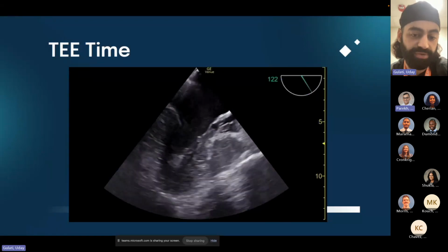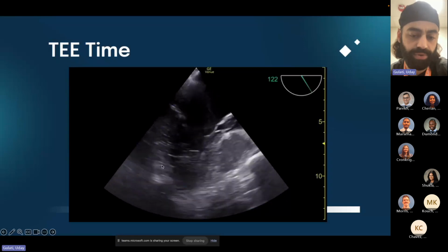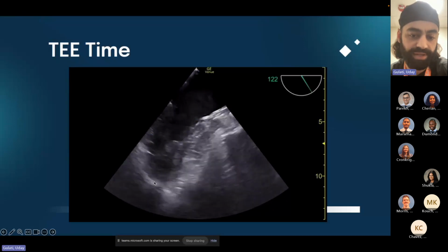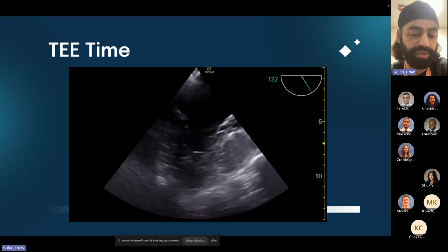Almost like SAM physiology. This is what ineffective compressions look like. What's happening over here, right? So you've got your left atrium over here, your left ventricle. Once again, this is your mid-esophageal long axis view. You've got your left atrium here, your left ventricle here. Look at that left ventricular outflow tract just completely compressed. You guys see it? I need to readjust the way I'm doing compressions because this is not helping the patient.